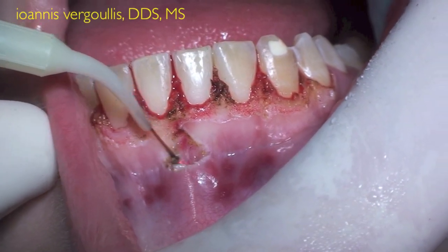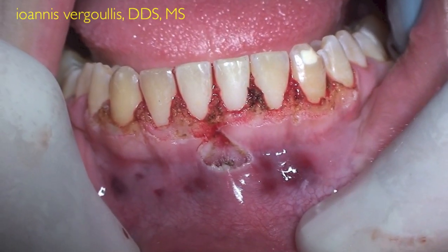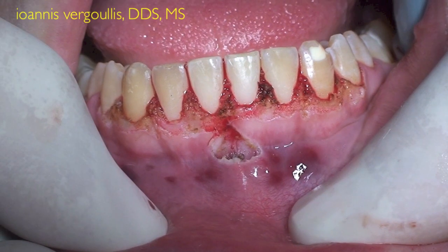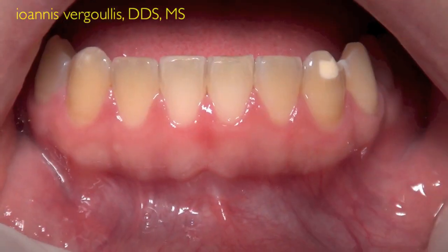At that time point, we also performed a minor frenectomy. And we do that to protect the free gingival margin of the lower central incisors from future recession that can develop from pulling of the muscle fibers upon masticatory functions. Here you can see that 3 weeks later we have a very nice result.